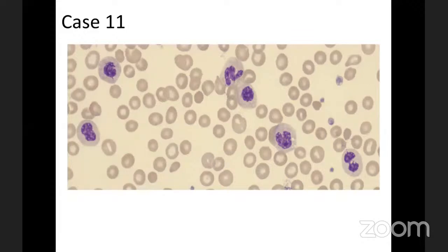So leukocytosis, those are neutrophils, but they look abnormal, definitely. Not all of them, but at least this one, this one, this one, and this one. Hypolobated, bilobed, monolobated, and also this one, an abnormally hypolobated neutrophil with hyperchromatin pattern.